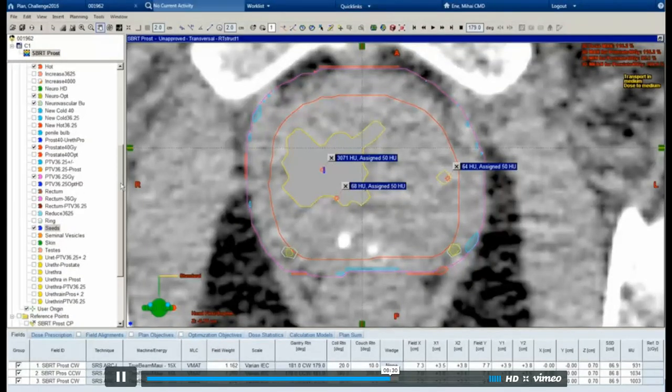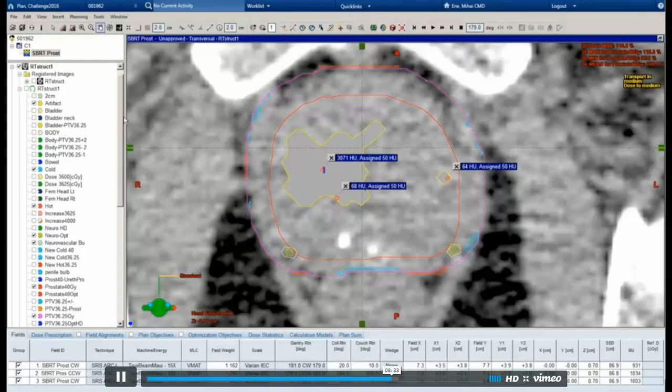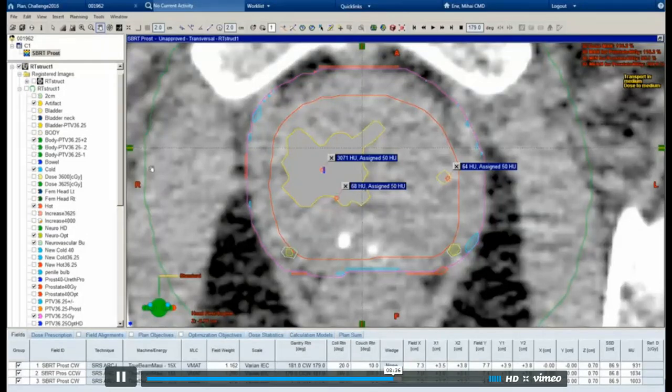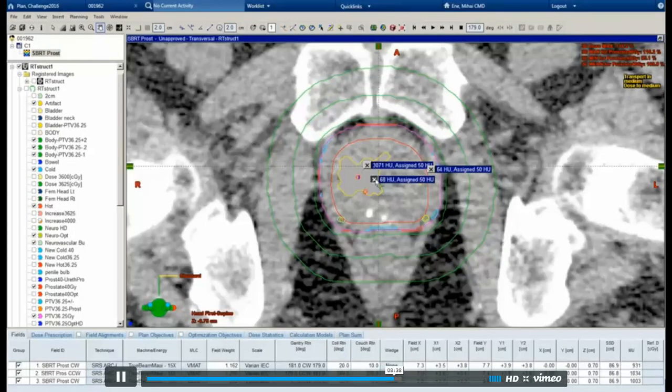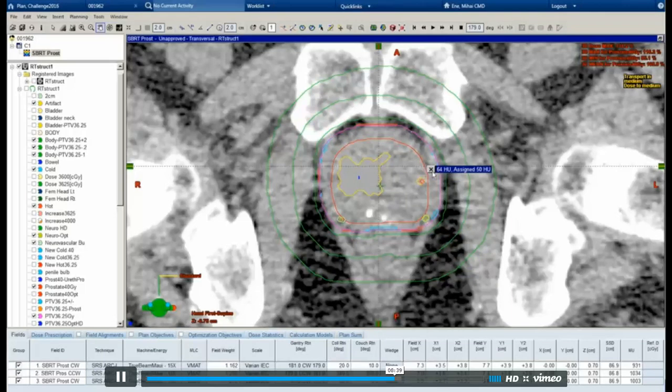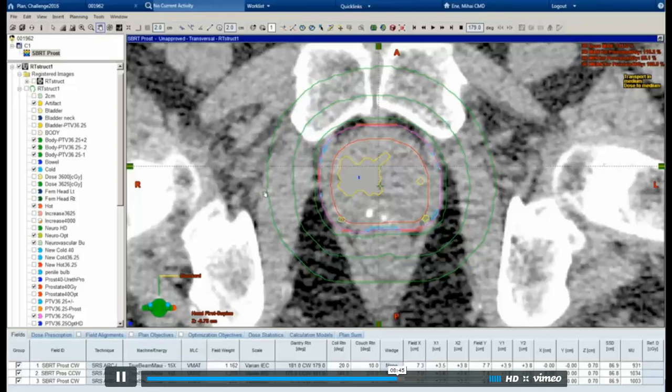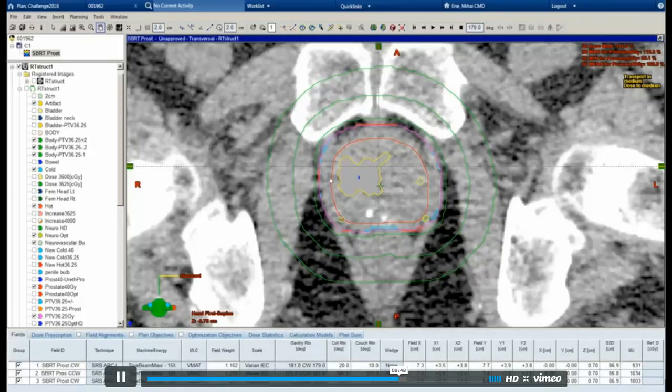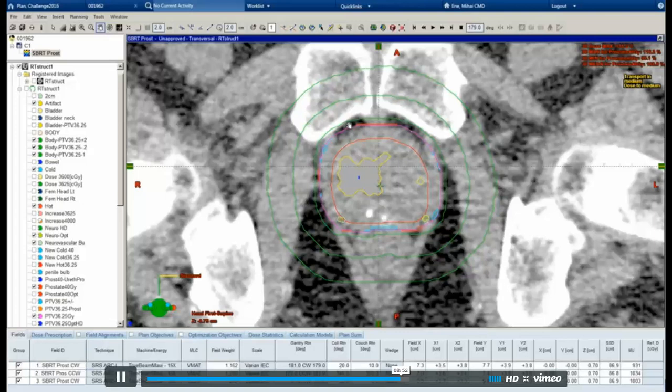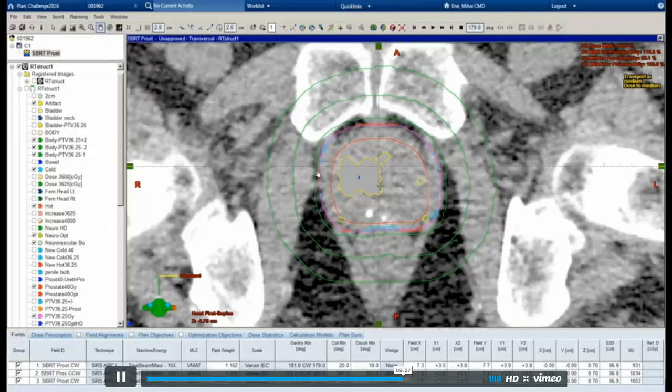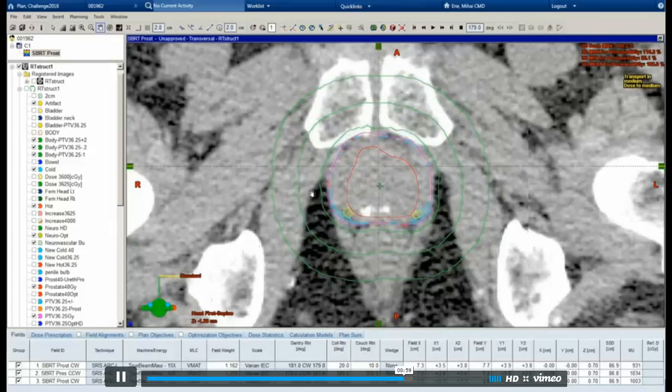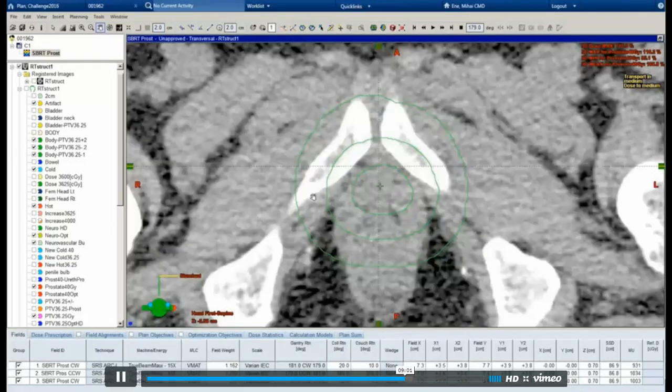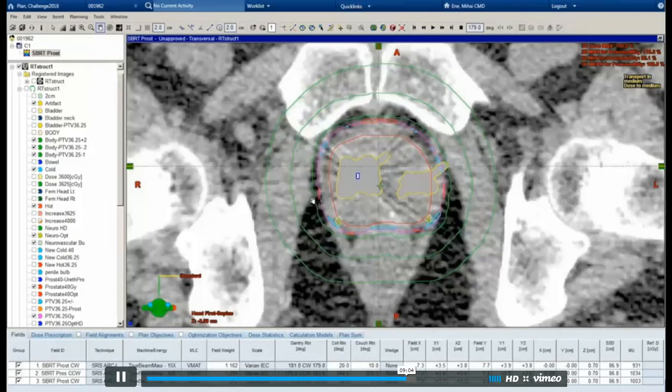Let's see, what else? I sometimes use a body minus PTV structure. It's kind of a ring. I didn't use it in this case, but I've had a lot of success with it. What I do is I just make a structure called body minus whatever PTV it is. I trim it a few centimeters or millimeters out of the PTV and I set a constraint on it. And it usually helps avoid the prescription dose spilling out of the PTV and makes the plans more conformal.